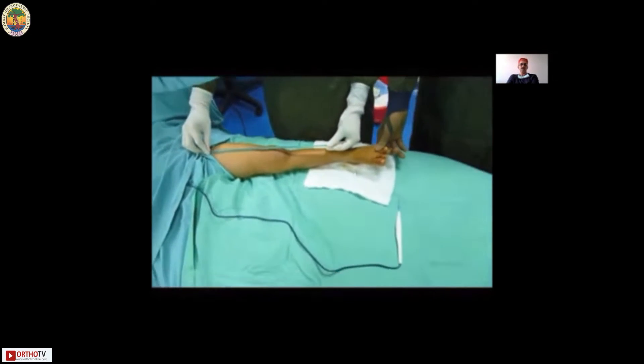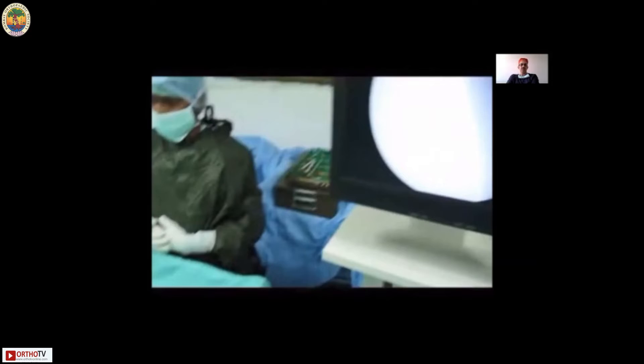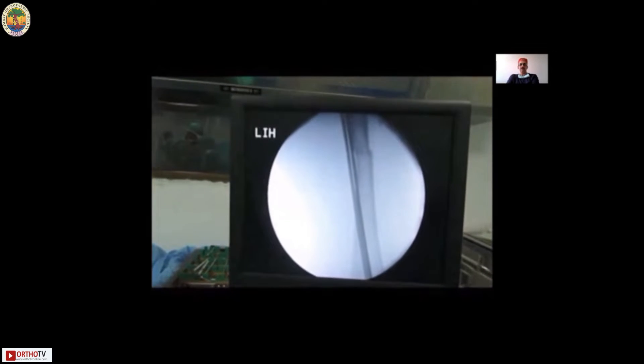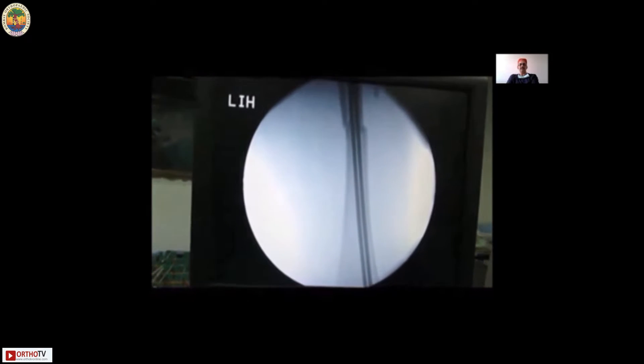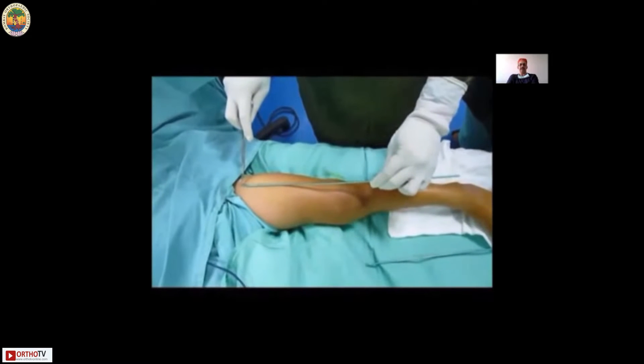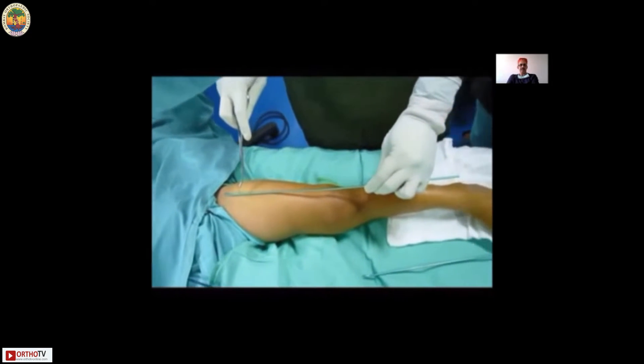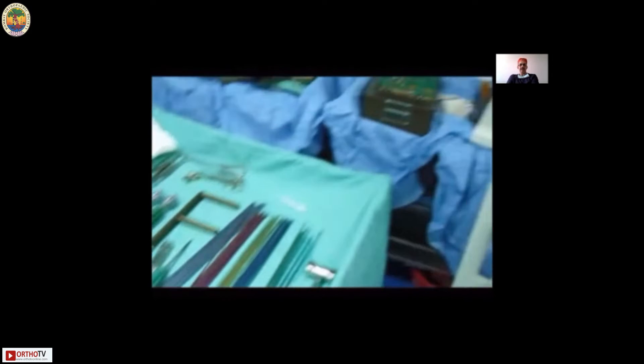Alternatively, you can just choose a couple of nails which you think are appropriate and place them on the femur so that you can see they are going to be adequate and occupy 80 percent of the canal diameter. As seen in this video, I'm placing nails on the shaft — that is the perfect amount of canal fill that I want.